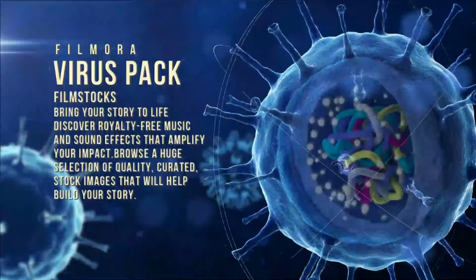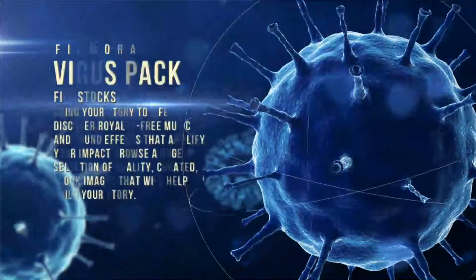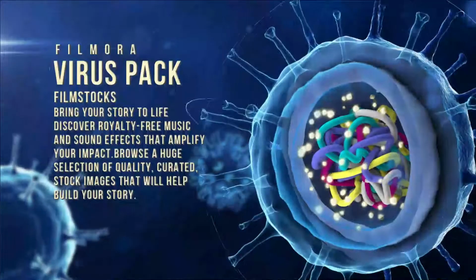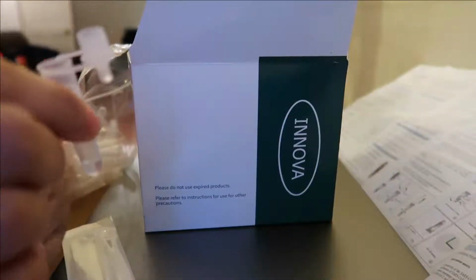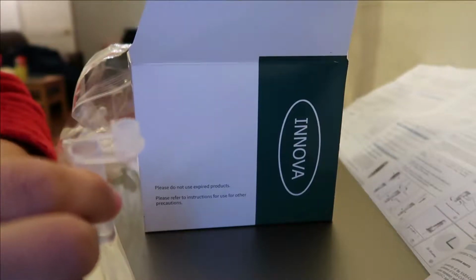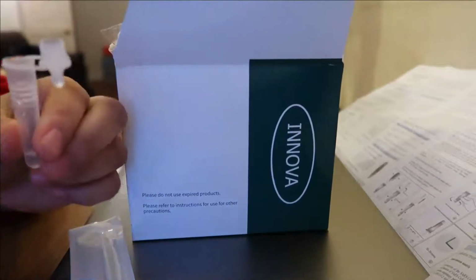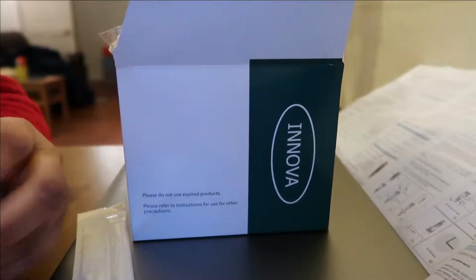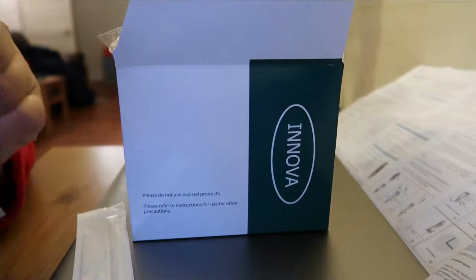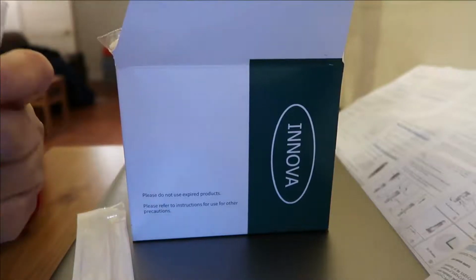6 drops, and then it's helpful if you have a rack, because you can't place this on the table since it won't stand on its own. It's best if you have something to put it in so it can stand on its own, but I don't have that. What I can do is just hold it myself, and I've been used to doing this already, so it's easy now. So I'm now going to open my cartridge. It has a wedge, so you can easily open it.